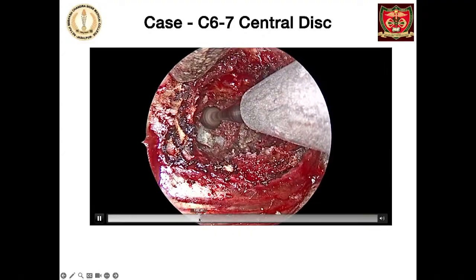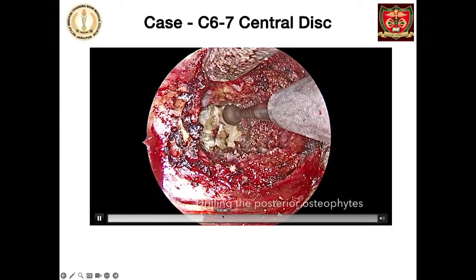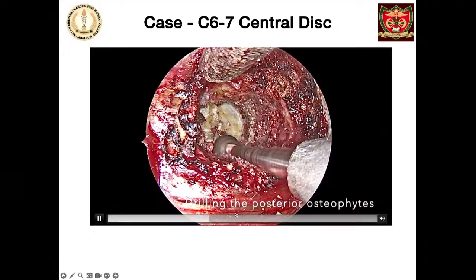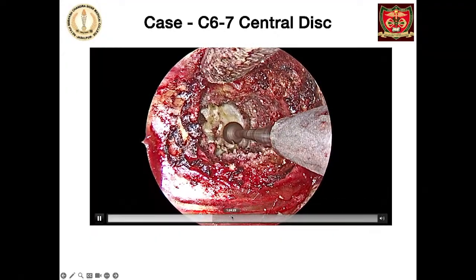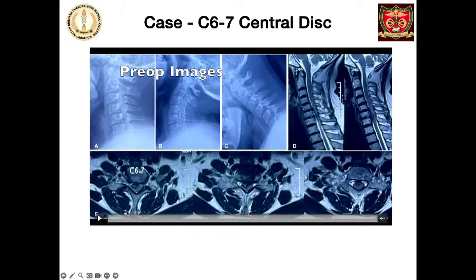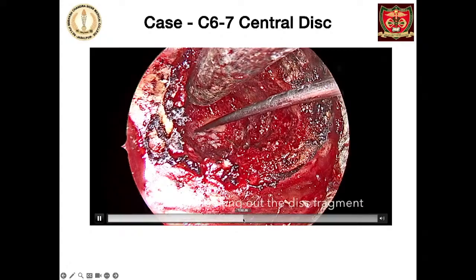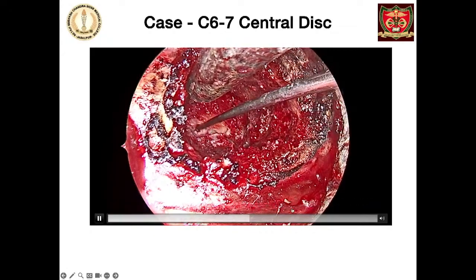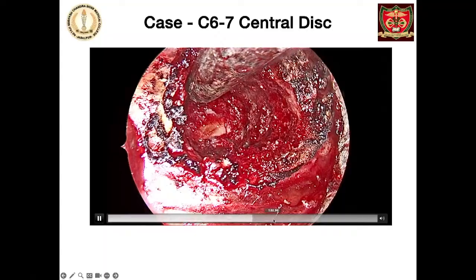So these two are the longus colli and opening the anterior longitudinal ligament. And further drilling has been done at the posterior osteophytes.